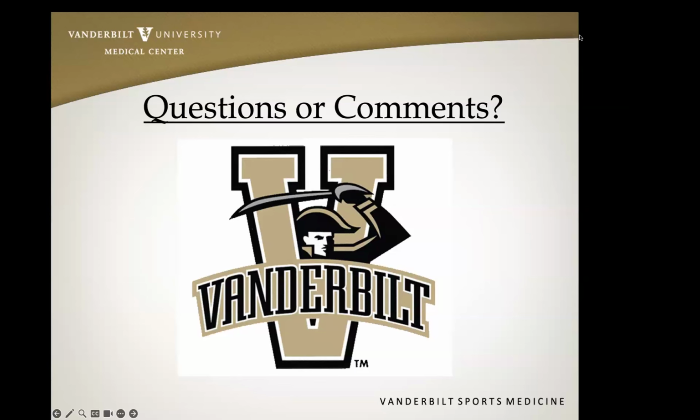On this particular diagnosis, one of the questions that you brought up right away was, do we need ultrasound to scan this or not? And I tend to fall along your lines with this. I tend to scan most of these that come into my clinic, and exactly the point that you made towards the end, looking at whether there is any disconjugate motion present with movement of the calf.